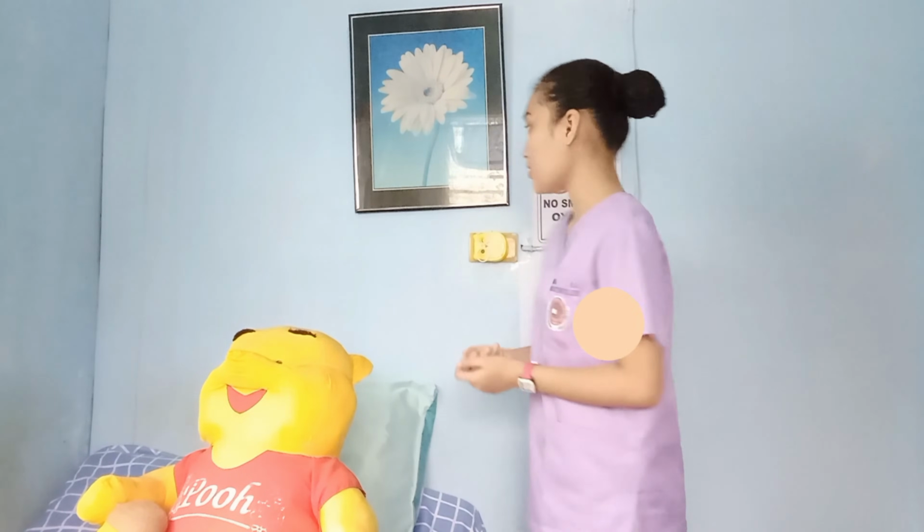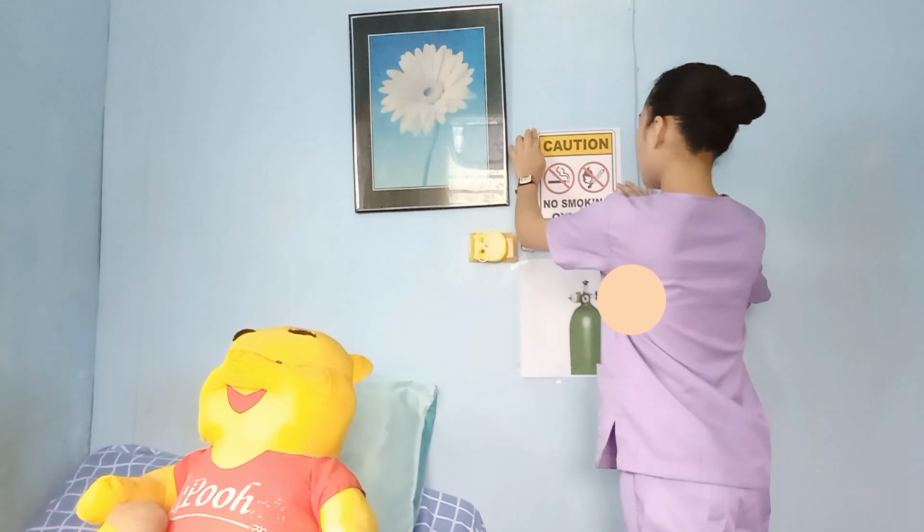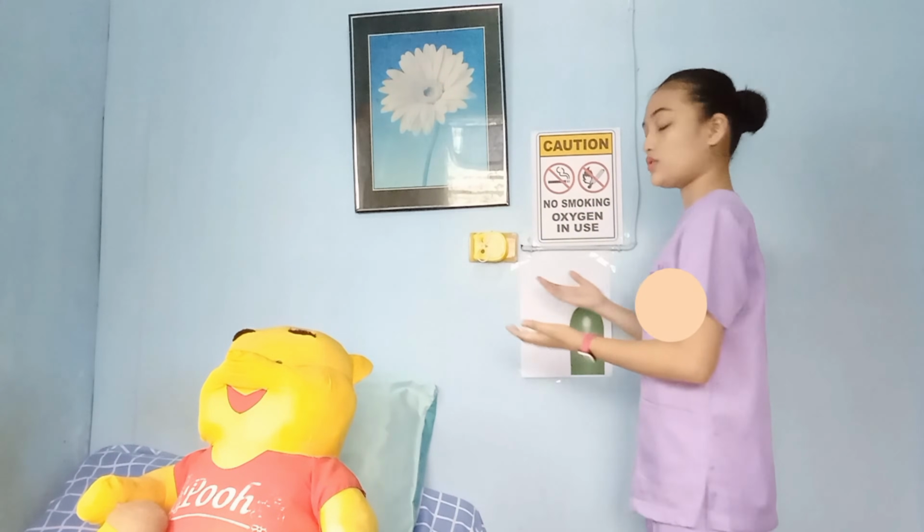Also, precautionary signs saying "No smoking, oxygen in use" should be placed on the door or on the foot or head of the bed or on the oxygen tank or somewhere where it could be easily seen by everyone, especially by visitors, so they become aware and take caution. So here is our "No smoking, oxygen in use" sign. Okay, also remind the people or the visitors about these precautions.